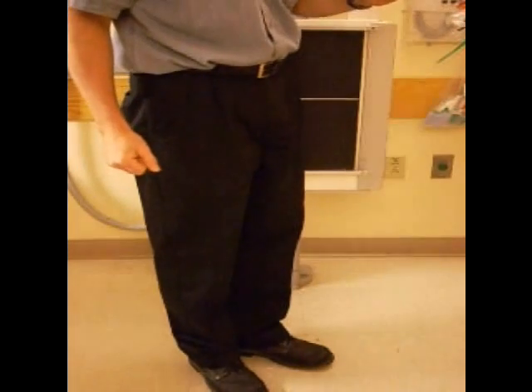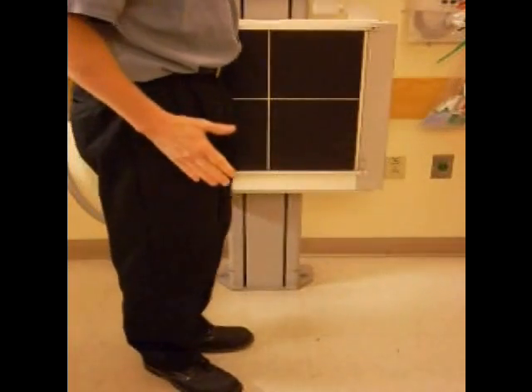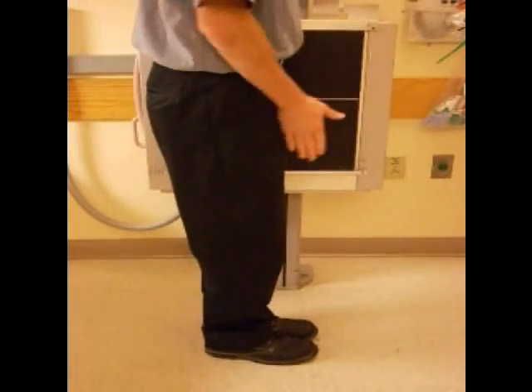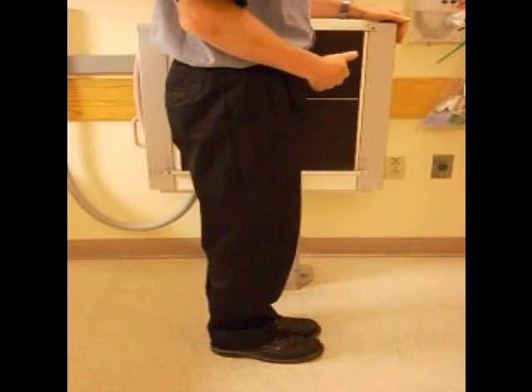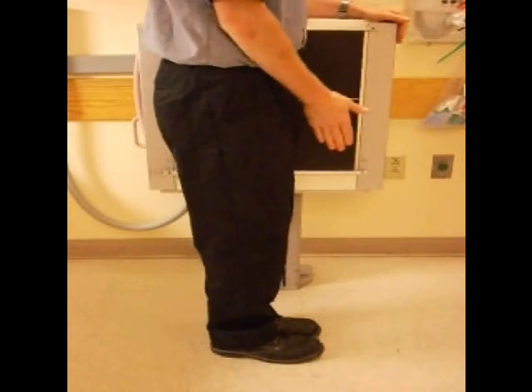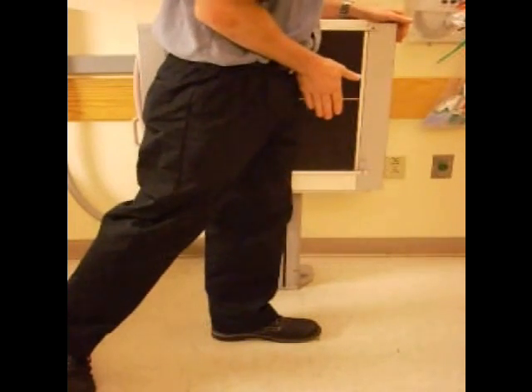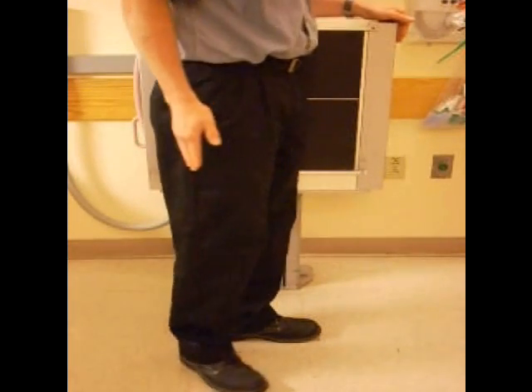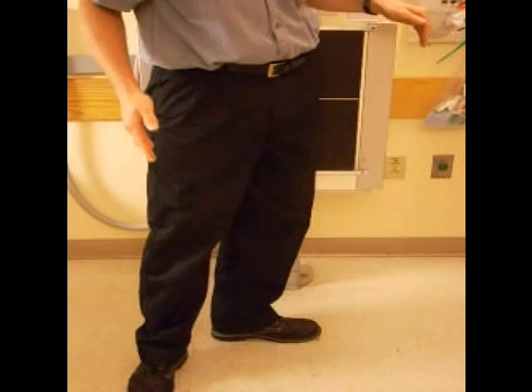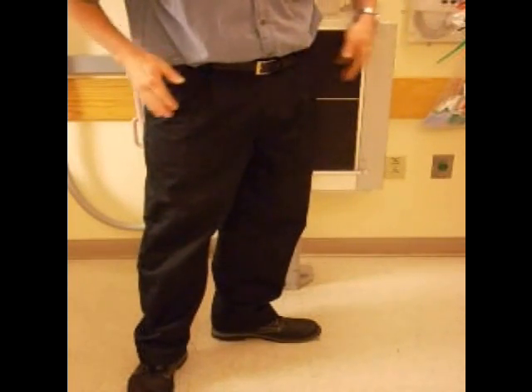I'd like to demonstrate a left false profile view of the hip. Start by placing the patient in this position, parallel to the film, with the left side closest. Make sure the leg is straight up and down, with the patient's weight on it, weight bearing. Take the unaffected leg, put the feet in this position, and the pelvis will come about 65 degrees.